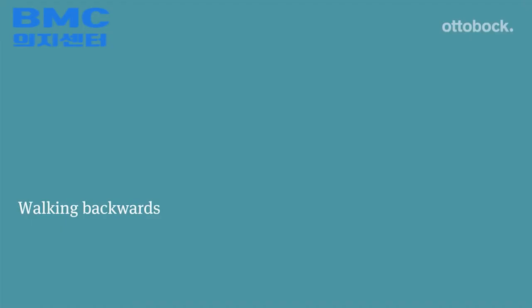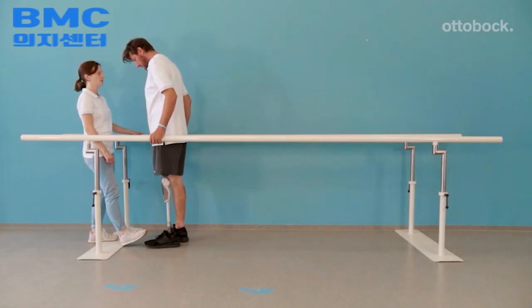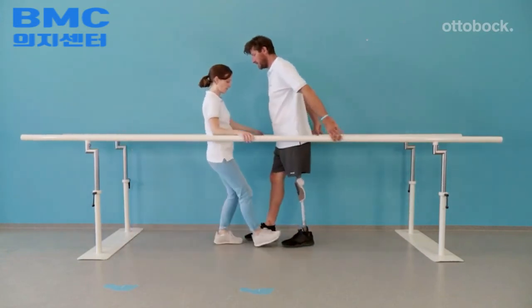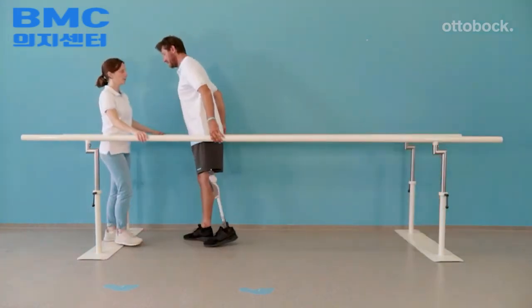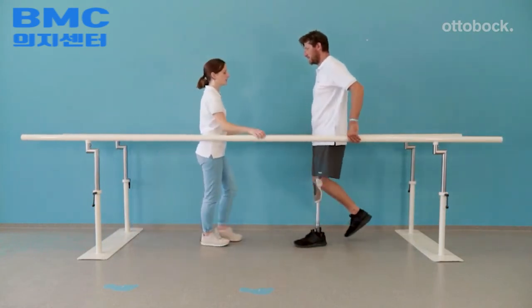With the 3R85 knee, it is possible to securely walk backwards. The therapist shows the model this additional functional possibility. The therapist slightly holds the prosthetic foot down to encourage knee flexion. The model demonstrates use of the hydraulic stance flexion resistance and yielding into knee flexion.